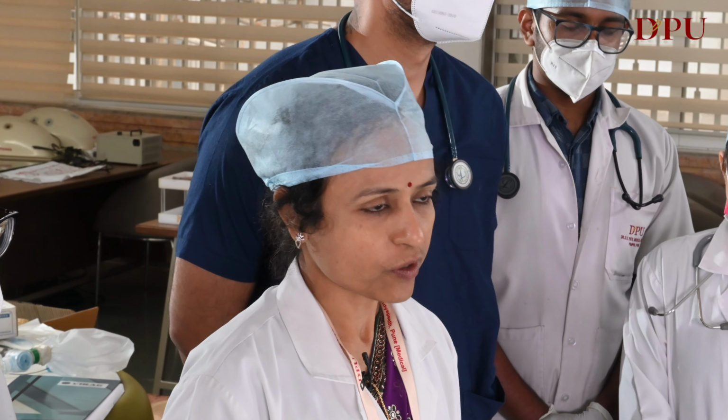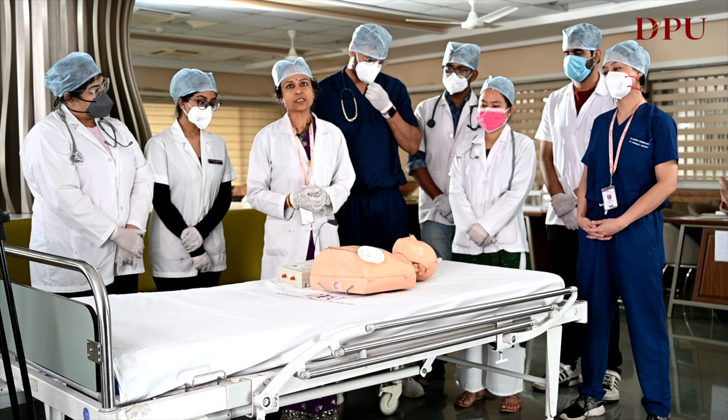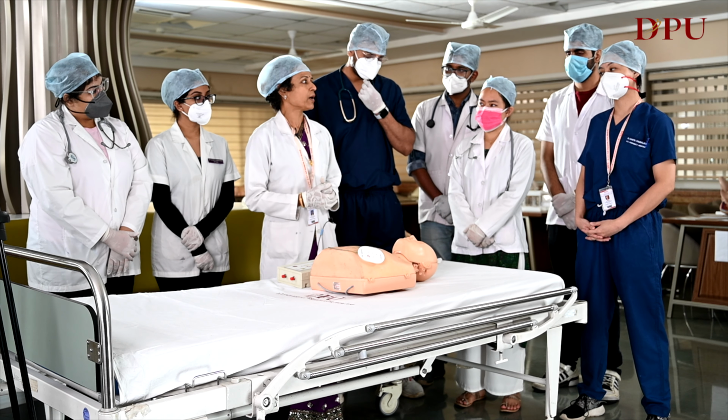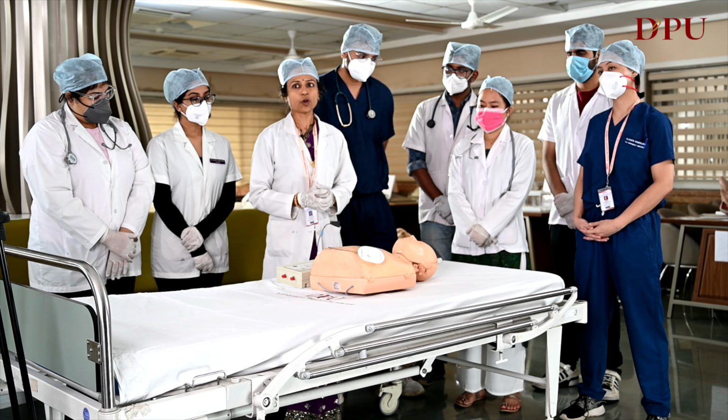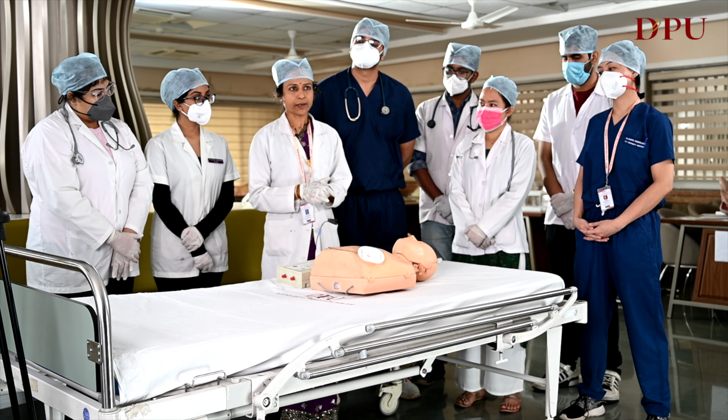Very good. Welcome to DPU Skills and Simulation Lab. Let's get started. So this is a session on automated external defibrillator, commonly called public access defibrillation, PAD programs in European countries. You all know that this is the most essential part of the treatment of cardiac arrest.